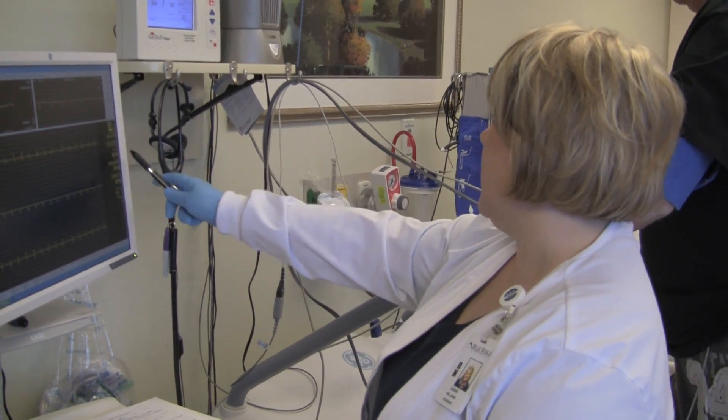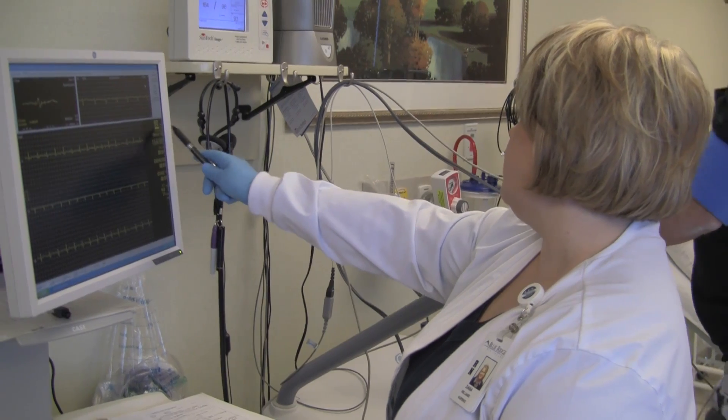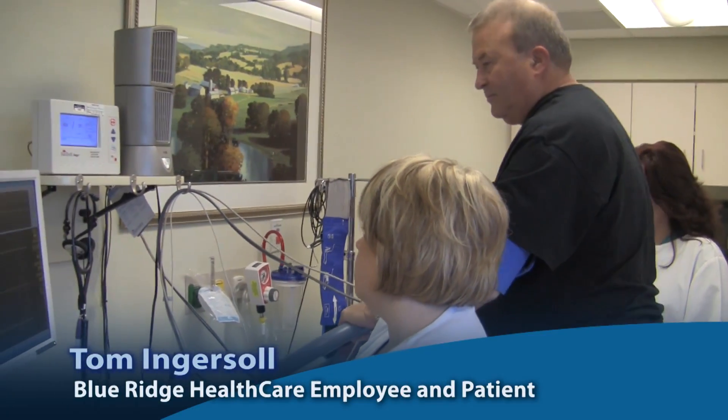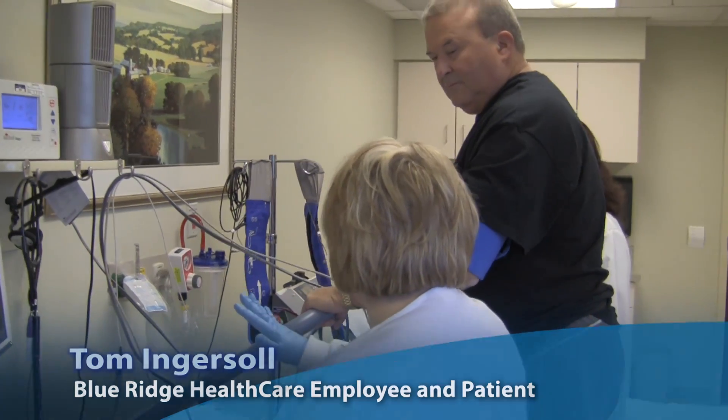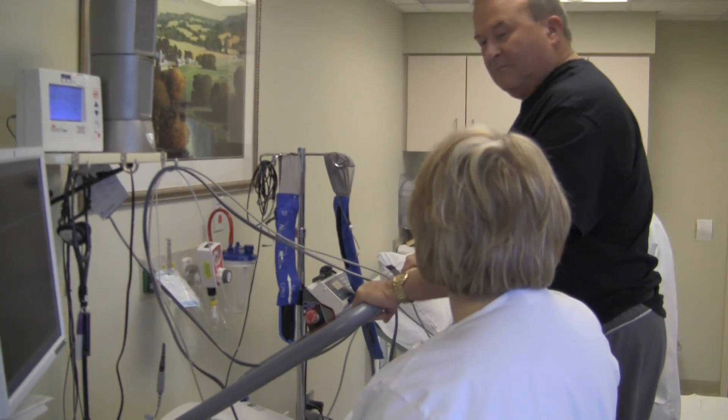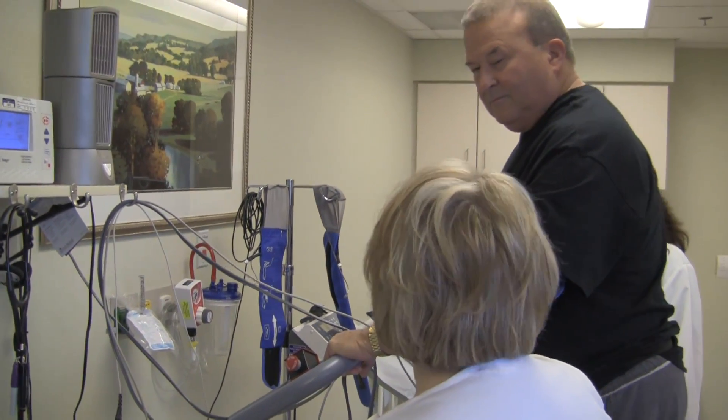Tom, there's where you are now — heart rate of 90. We're trying to reach 158. You've almost been walking for about a minute. At the three-minute marker it will elevate a little higher and go a little faster. When you feel your blood pressure cuff go off, that means you have one more minute left at the speed that you're at.